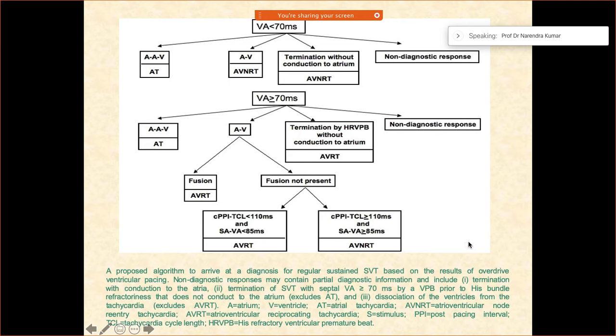When you are doing RV entrainment, you do not see any fusion. This is also very important. Two important things you should never forget.